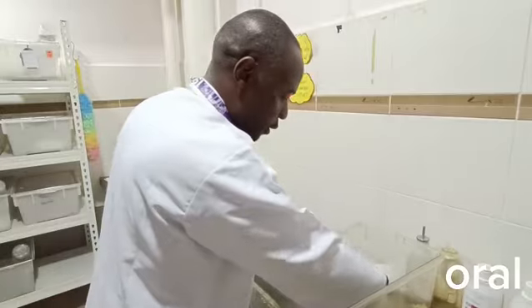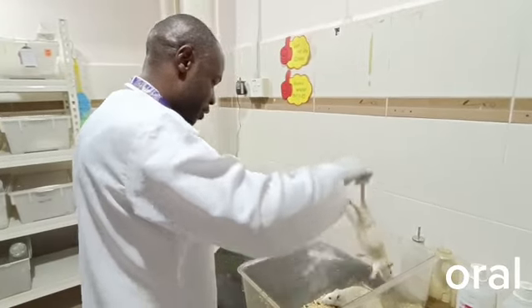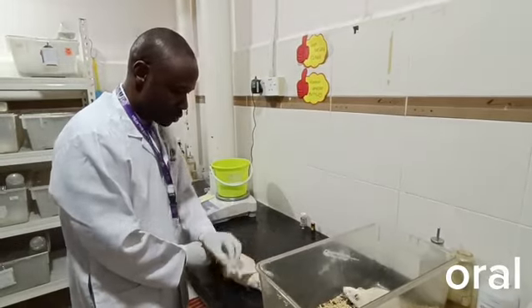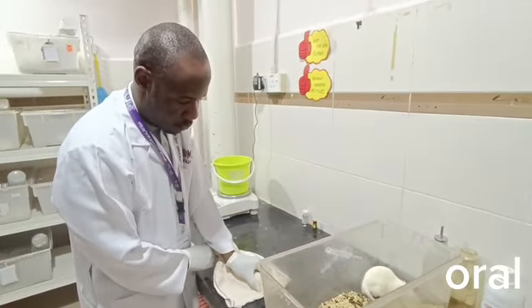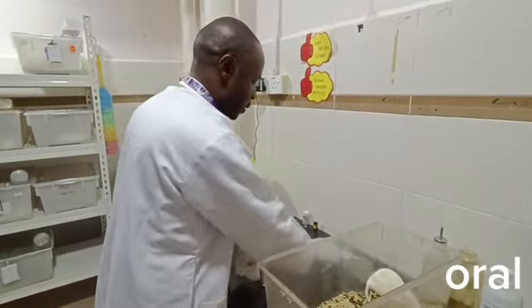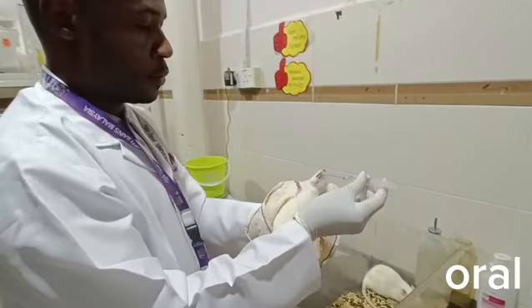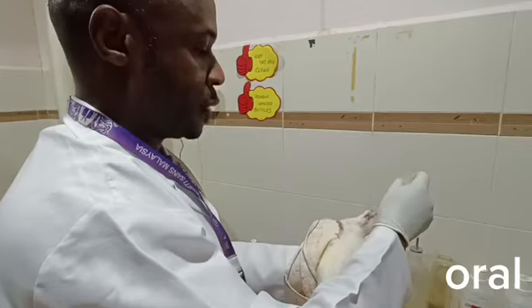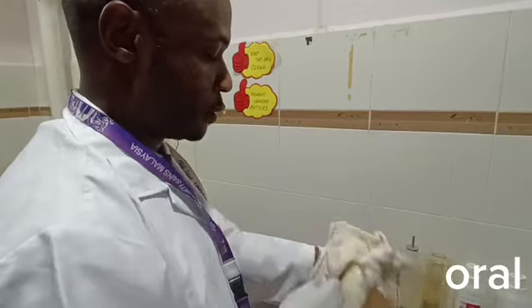Okay, so you get the rat. Then hold it carefully and make sure the gavage needle is inserted like this. Then you press. Then it's taken already. So you drop the animal.